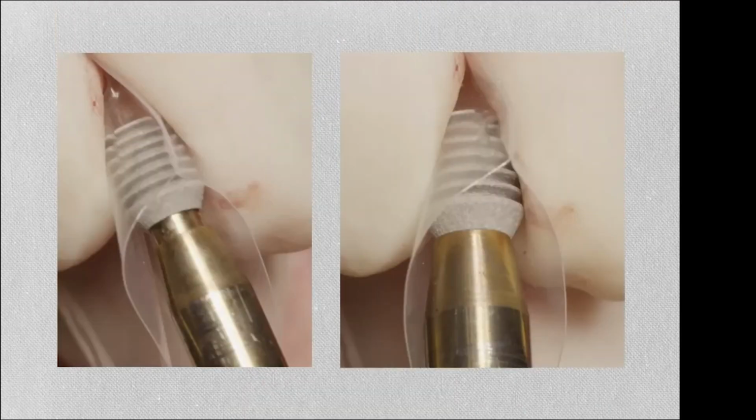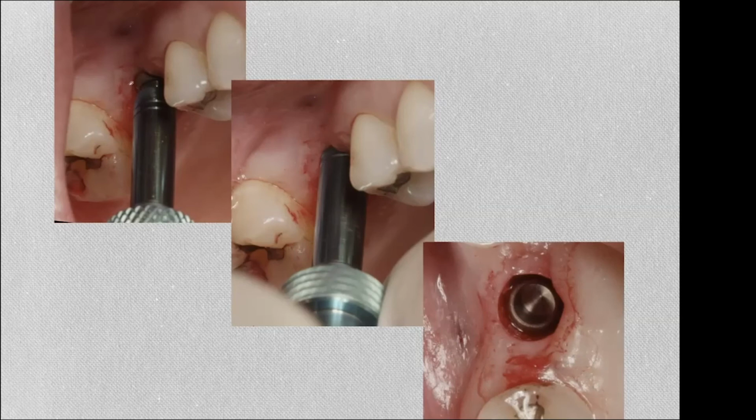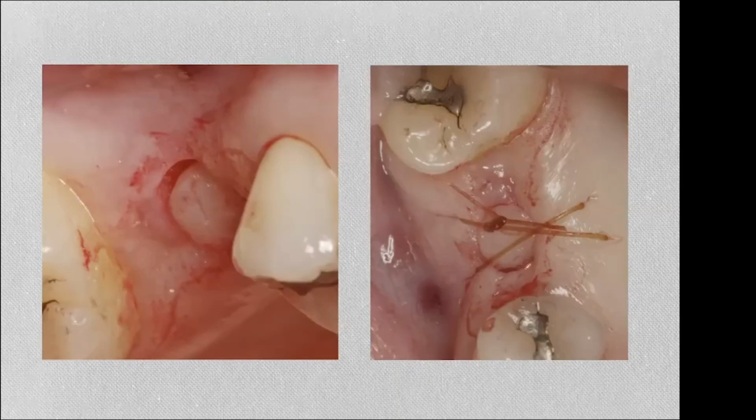Now, for the sake of illustration, we used the surgical guide to place the implant, but only at the fullest depth, because I wanted to show you how it looks. With the guided surgery kit, place it right through the guide till it's fully seated. But as you can see, it's still pretty proud, very high in there. It needs to sit 2 or 3 millimeters deeper. So I use these markings on the regular inserter retriever to tap it until I'm happy with the seat. And then I seal it with the black healing plug. Then the autogenous bone goes over, and the gingival plug is retrieved. We keep it in saline and place it over, and then a strapping suture holds it in place.